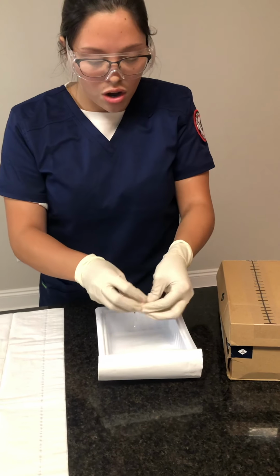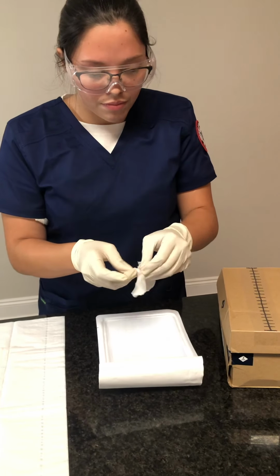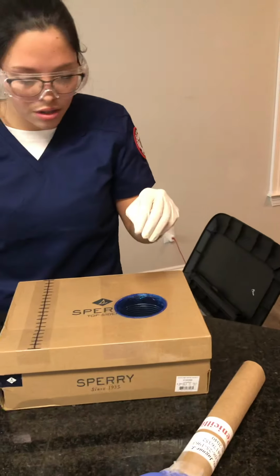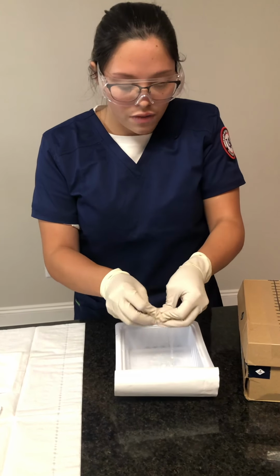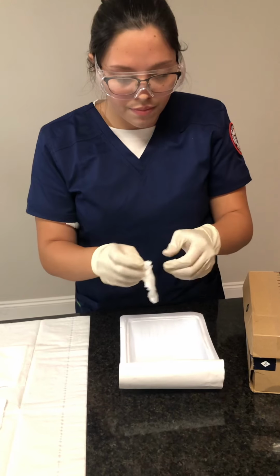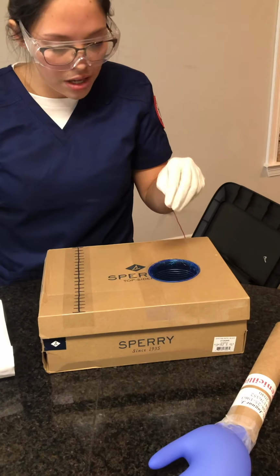I will strain the gauze first, and I will fluff it out. And drop it in the wound without touching the edges of it. And I will repeat this process again by draining any saline out of the gauze and fluffing it. And dropping it in the wound without touching any of the edges.